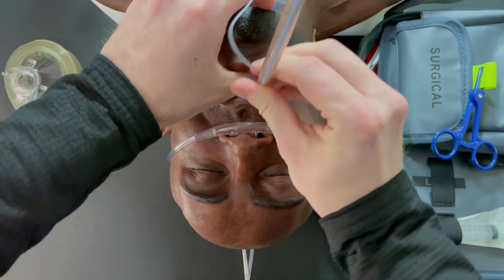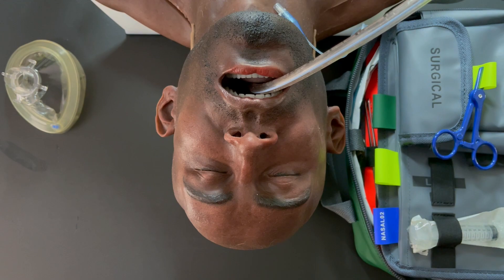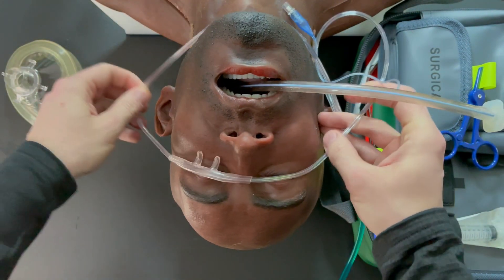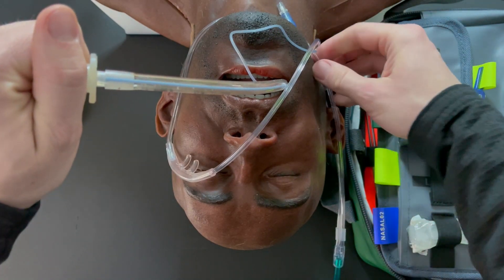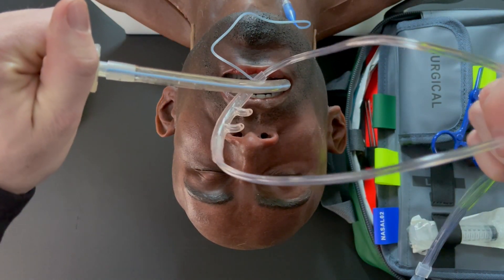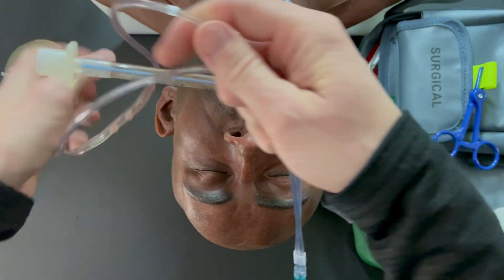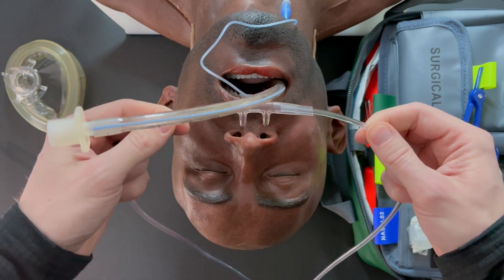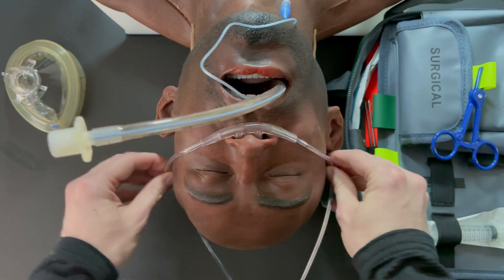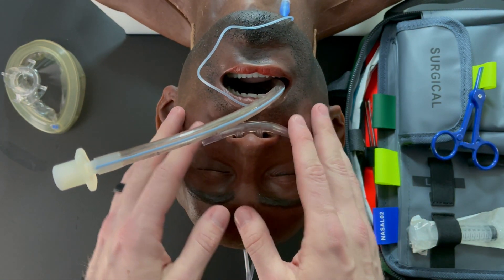Having the cannula routed over the top of the head allows you to remove it without breaking the circuit after intubation. If it were looped around the ears the normal way, it would create a loop around the ET tube, which has a ventilator or bag-valve mask attached — and you'd get stuck. I've seen people cut or break cannulas because they don't want to break the endotracheal tube circuit. So this might look a little silly, but keep the prongs facing the correct way, tuck it around the backside, and remember: at least 15 liters during your intubation attempt.